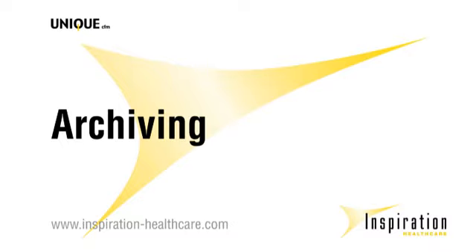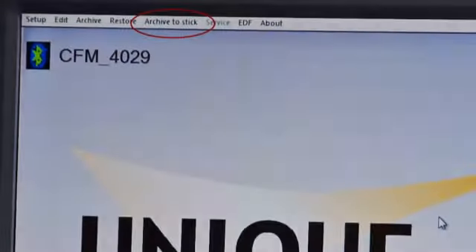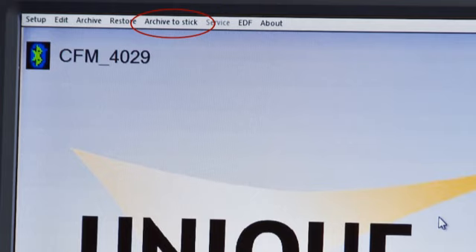To archive to a flash stick, click on the archive to stick button at the top of the master screen. Archiving to flash stick does not remove the patient data from the computer.